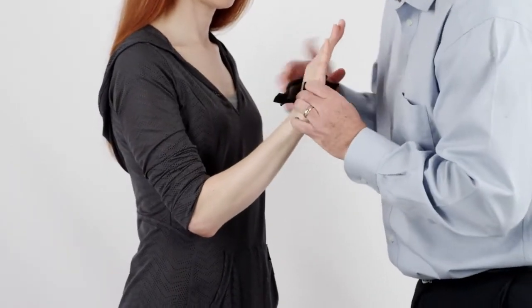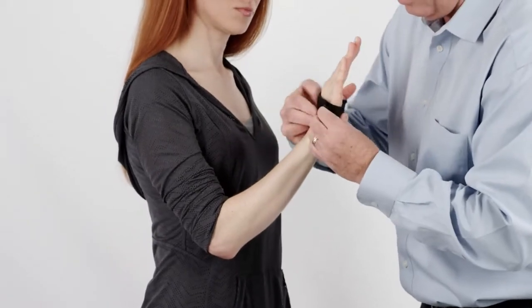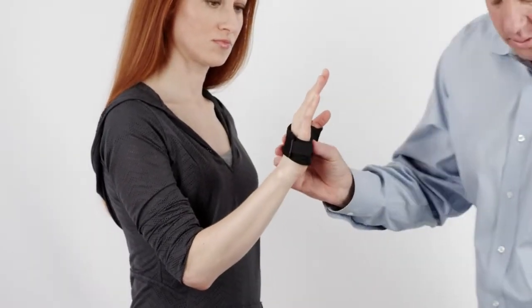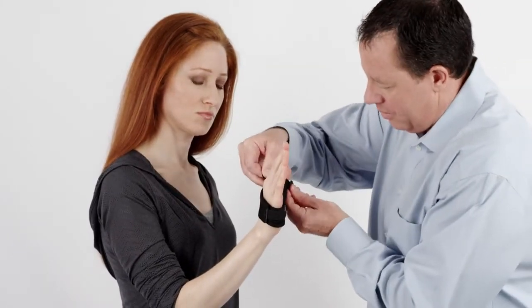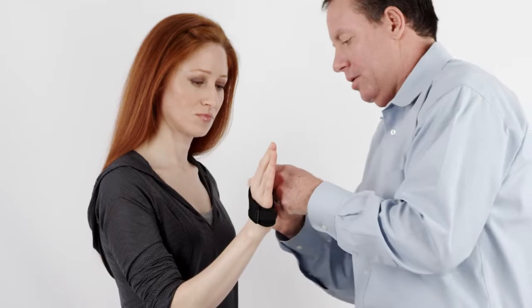Gently pull the underlying tab to remove slack from the material in the palm. Secure hook and loop tabs on the dorsal side of the brace. Secure the accessory strap in the desired position on the thumb.